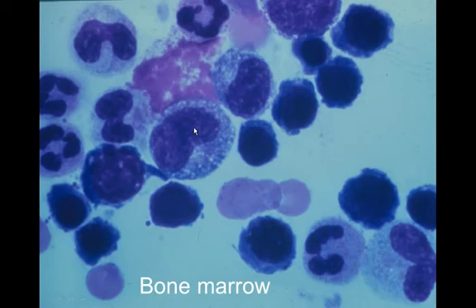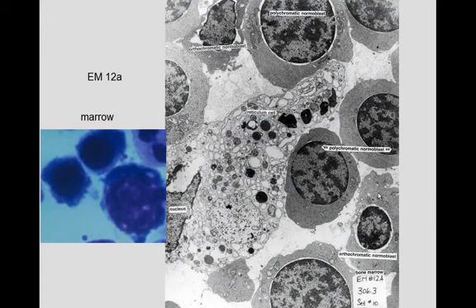So if we look at the bone marrow, we can see some cells that have a spherical nucleus. Here's one right here. And then there's another one, a darker nucleus. There's another one there, and there's another one. All these are part of the red blood cell line. Here we can see a larger one, like a polychromatic normoblast, and then these were normoblasts in through there.